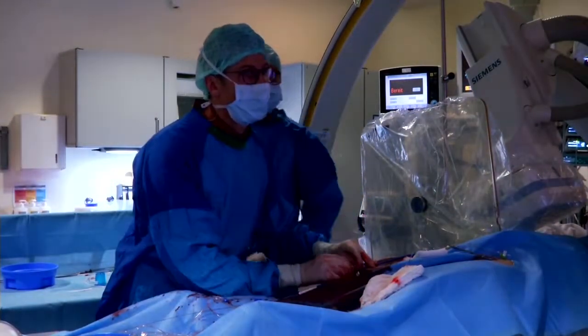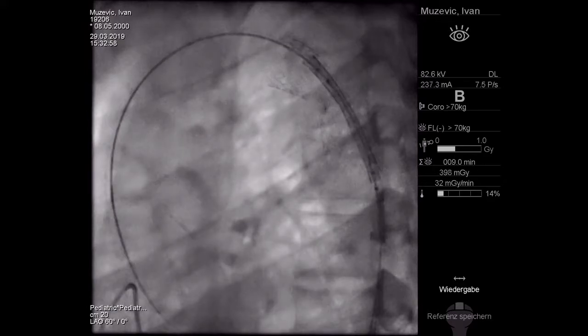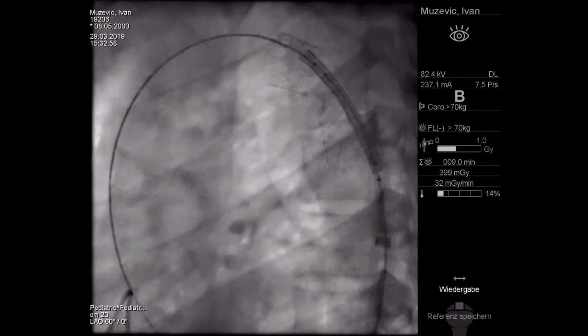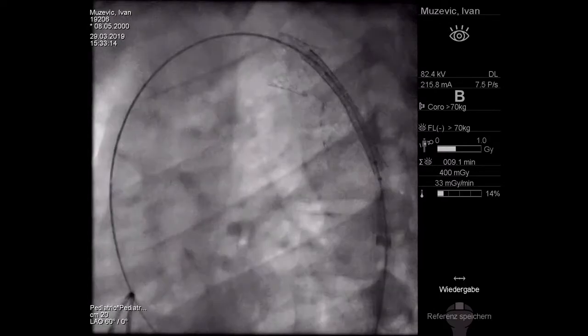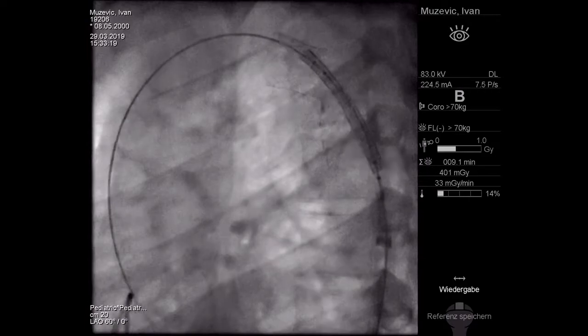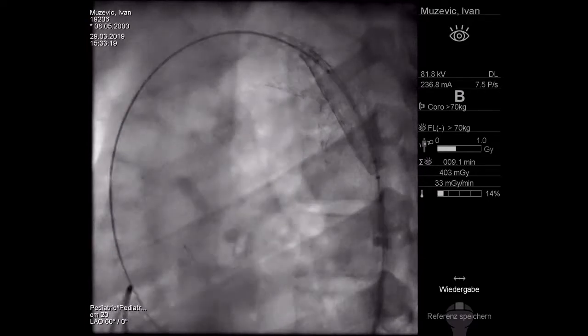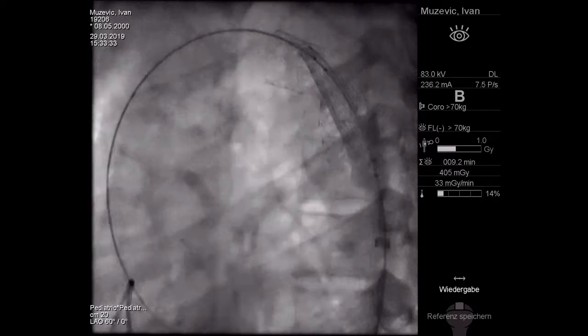So we have now a long stent here. I'm a little bit afraid. Perhaps I think I keep it there. I don't want to mess it up with the other stent. We take the inner balloon. Just a second. What is the stent you have chosen? What is the stent you're working with? Just a second. I speak with you in 2 minutes, okay?